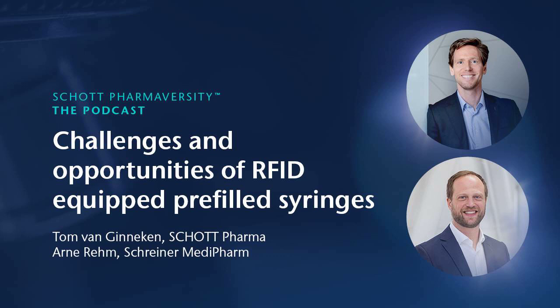But in particular, liquids have a very large impact on the functionality of RFID, meaning the reading range is quite limited, which then prevents really making use of the benefits of reading in bulk. If you cannot read them because you are too far away, then it really does not work as expected.